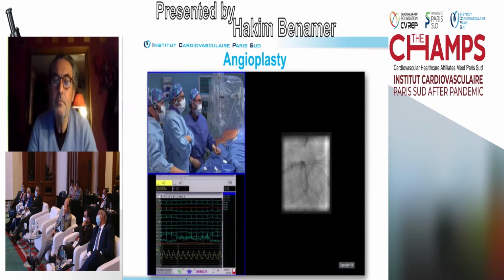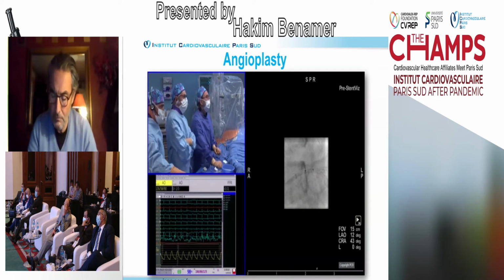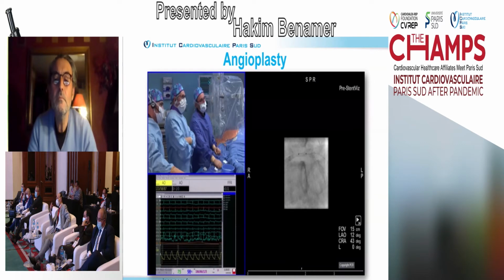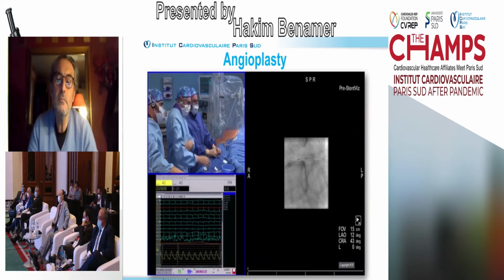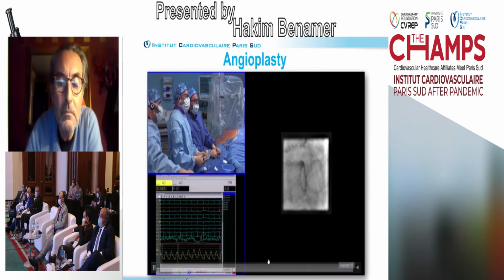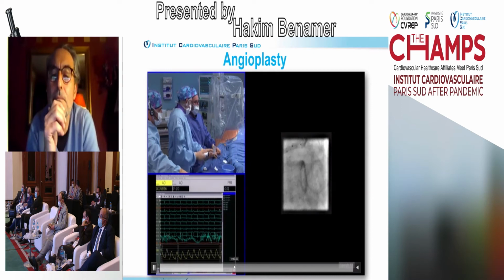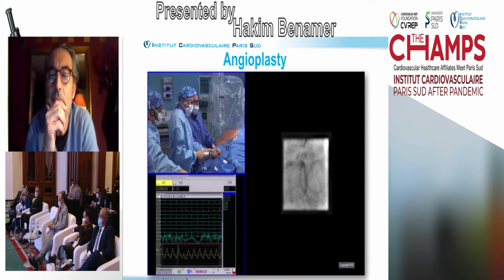For example, in this location here, we could see how they could find the spotty calcifications that in this case we already knew were there. It was nice to see that in this patient the left main had virtually no calcification whatsoever.